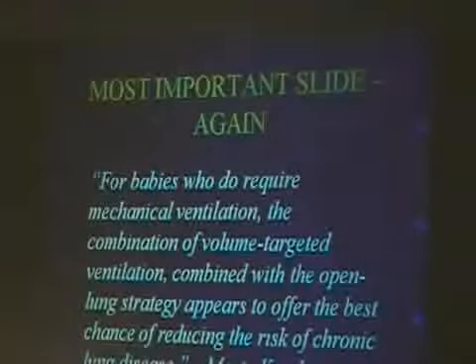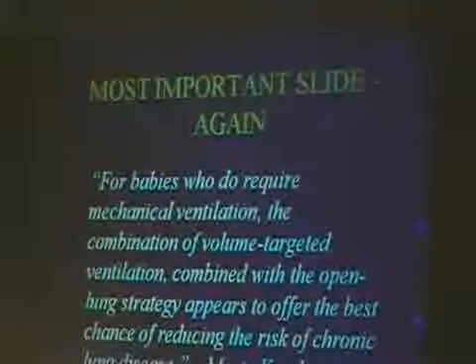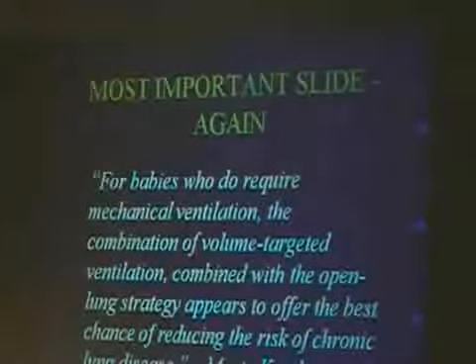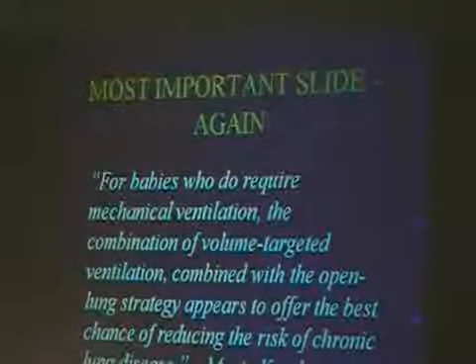But nonetheless, you do want to try to keep your tidal volumes in range as much as you possibly can to minimize further lung damage. And of course, try to prevent it in the first place by keeping optimal open lung strategy and optimal tidal volume.